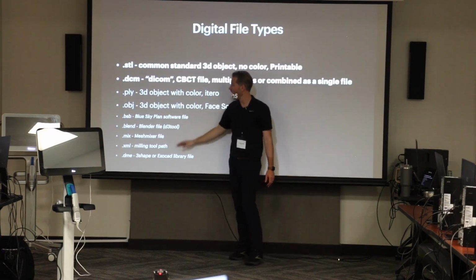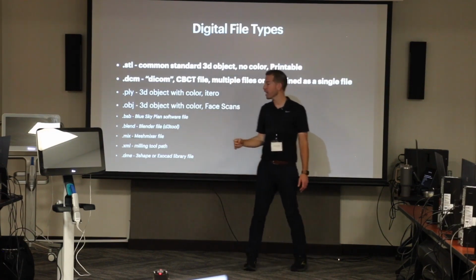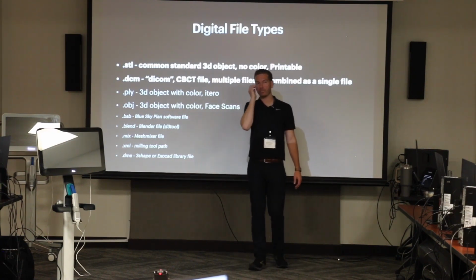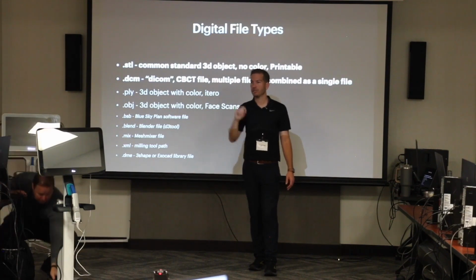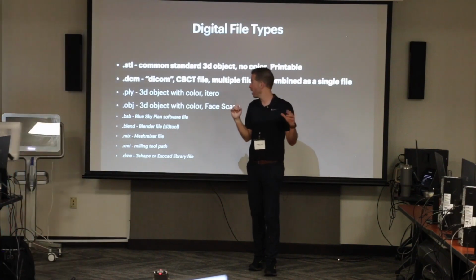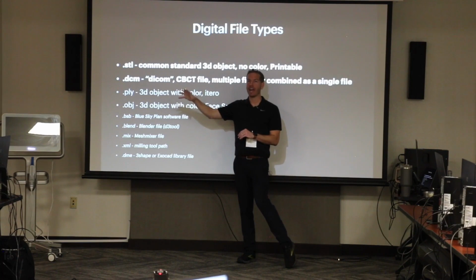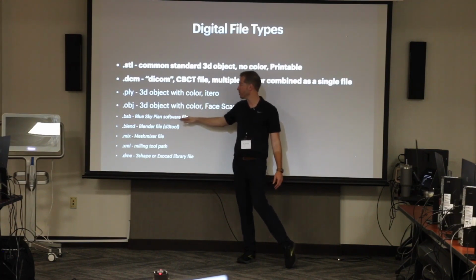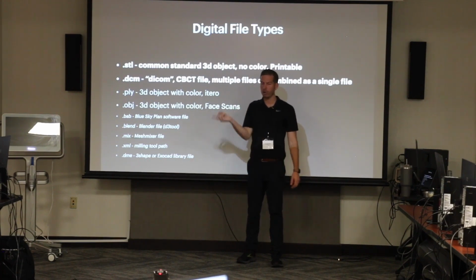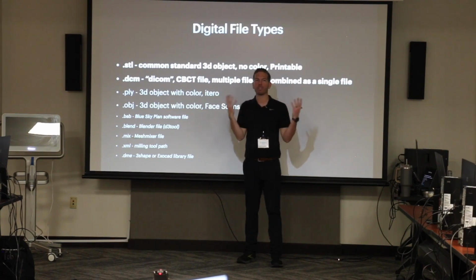The last thing is, I want to touch on this because I get this question a lot. When you go in a software and you go up to File Save and you save your scene, or you save your application, you save where you're at, you're saving it as a Blue Sky Plan file, like a .bsb. And so a lot of times people are going up, they're like, I hit File Save. Why won't it open my surgical guide? Well, you just saved the Blue Sky file. It's like you saved the Word document.